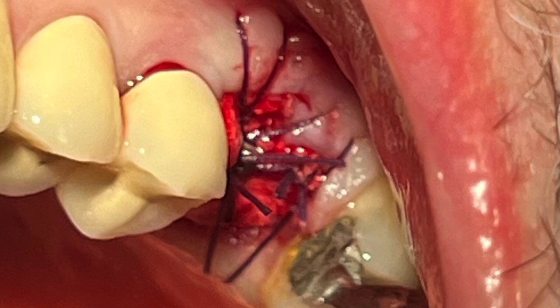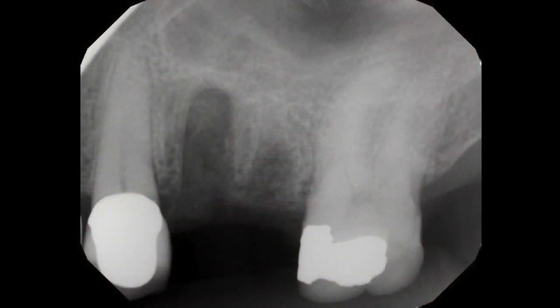I always take a radiograph, and you can see immediately post-operatively the material. It has some radiolucency to it, but over time — in a quick three to four months — you'll be able to objectively determine the bone turnover and prepare the site for an implant.